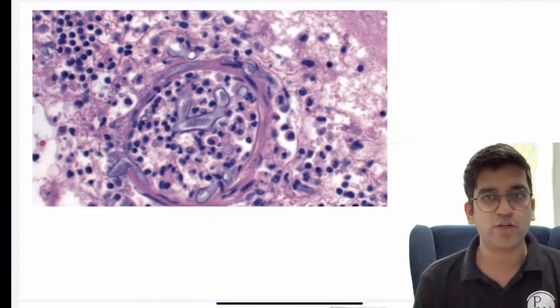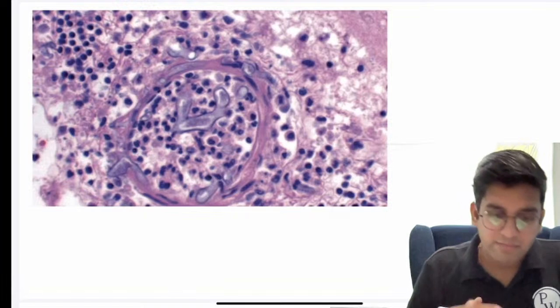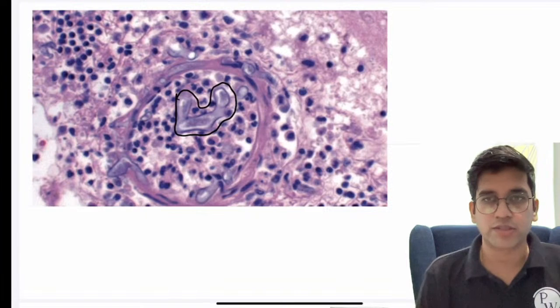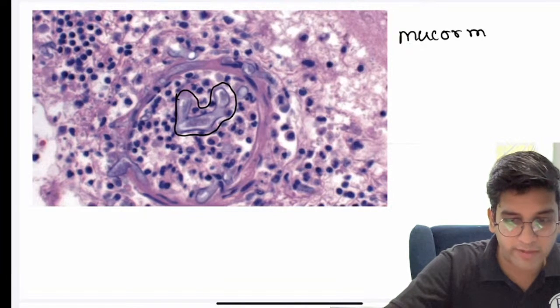After that, I'll mark where to look. Let's see if you can pick up the diagnosis before marking. You guys are amazing. You can do it. Okay, I'll mark now. This is what I want you to focus on here. Tell me now, what's the diagnosis? Perfect. It's a classical case of mucormycosis.